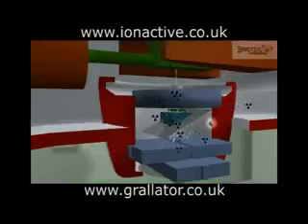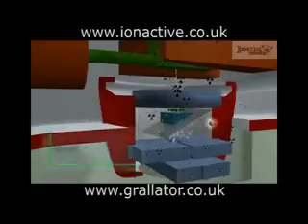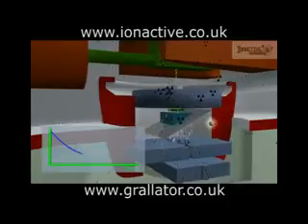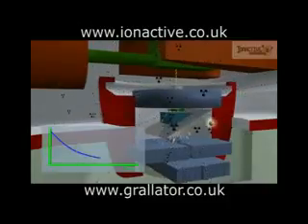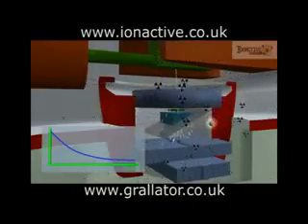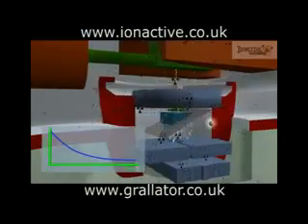The activated materials in the treatment head can deliver a dose to staff dismantling the head for setup and maintenance. The activated products are usually short-lived, so any radiation hazard during dismantling can be reduced by waiting for several hours after the last irradiation has finished. Because of the short half-life, it is unlikely that a significant buildup of activated material will occur.